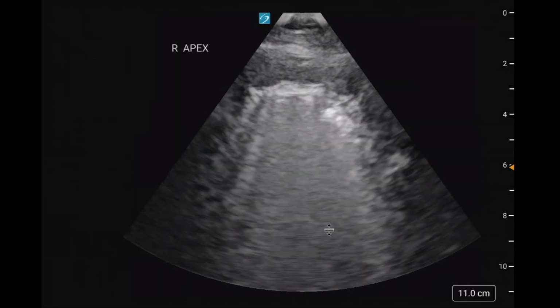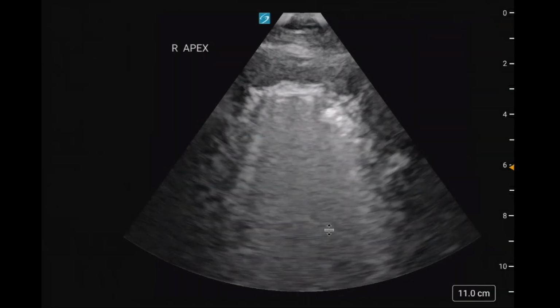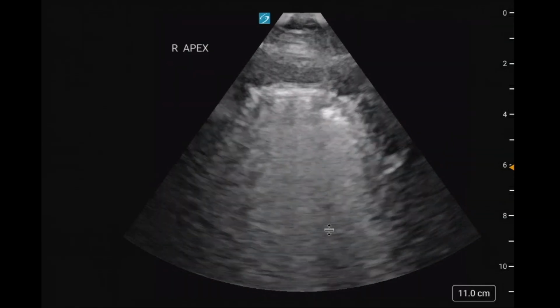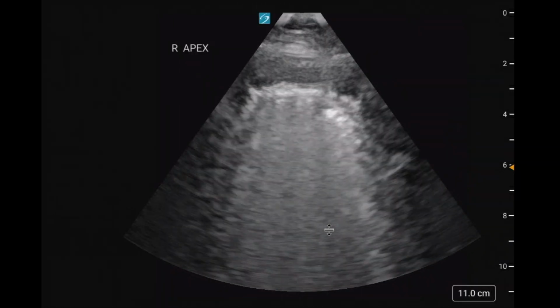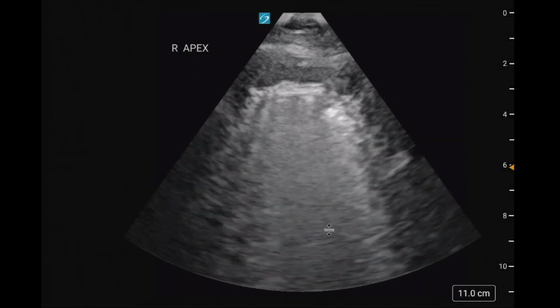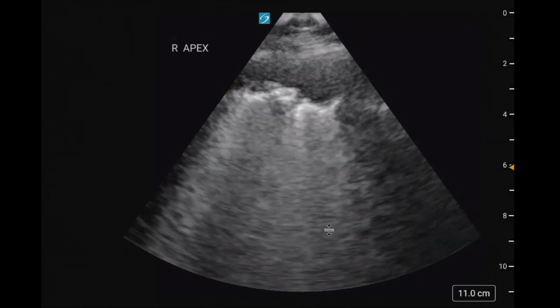And then we notice that the pleural line looks pretty thickened, right, and kind of irregular. So what sort of things can cause that? Yeah, so thinking of anything that can cause scarring or irritation of the area. For example, this patient has a malignancy, so that can be a cause of the thickening. So anything that causes inflammation, scarring, that kind of stuff. Right, so mass is a big one, and then sometimes pneumonias can cause a thickened, irregular pleural line.